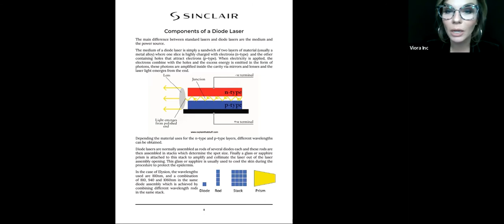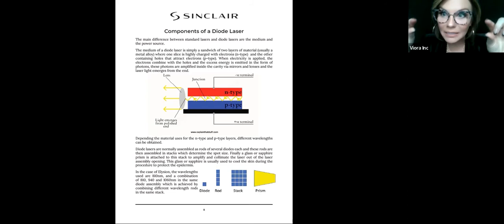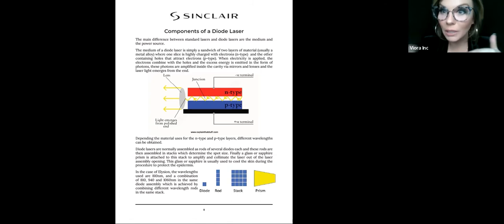So what is a diode inside? It's really a sandwich of two layers of material, usually a metal alloy. One slice of that, the top part, is called the N-type, and it's highly charged with electrons. So think back to what I was just talking about: we need the electrons, therefore we get the photons. And the other at the bottom is called the P-type, and that contains holes, and the holes attract the electrons. So when the electricity is applied, the power source is applied to it, and everything gets excited like it does, the electrons combine with the holes and the excess energy is emitted. And that's when we start to form photons.